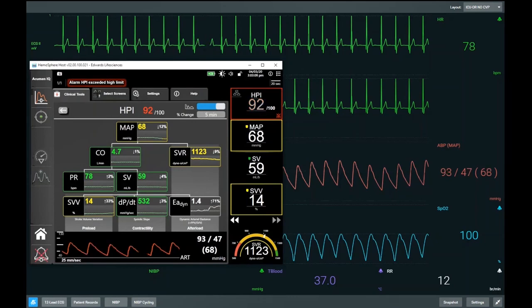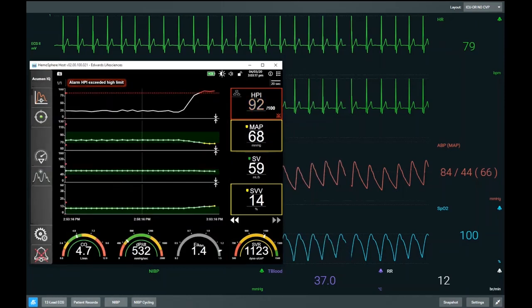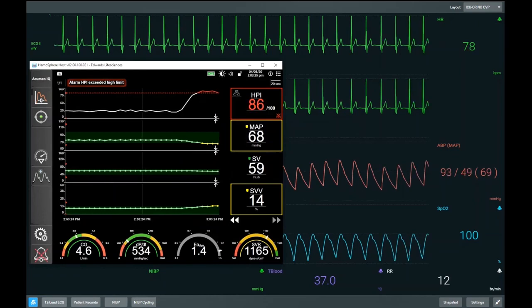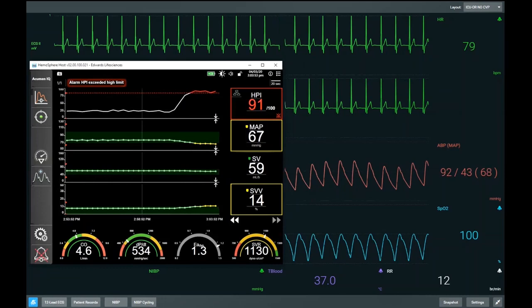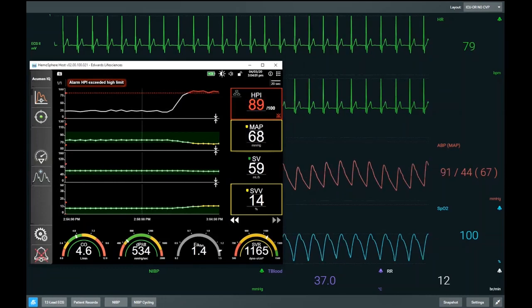Eadyne is a potential measure of whether, when you're preload responsive, you will also be a pressure responder. Eadyne is our dynamic arterial elastance, defined as the ratio of pulse pressure variation divided by stroke volume variation.